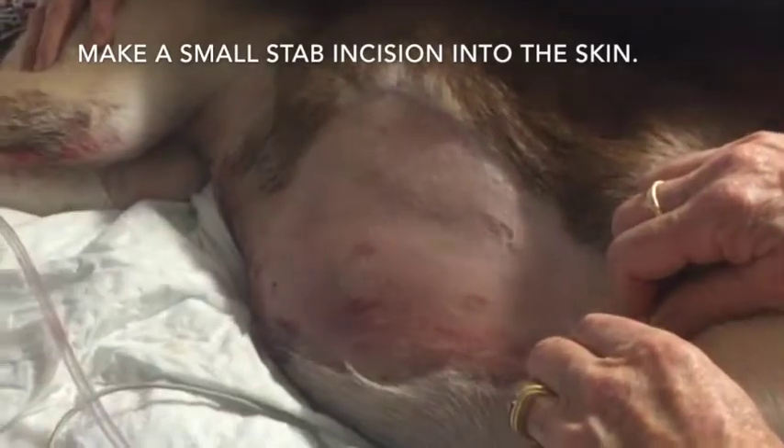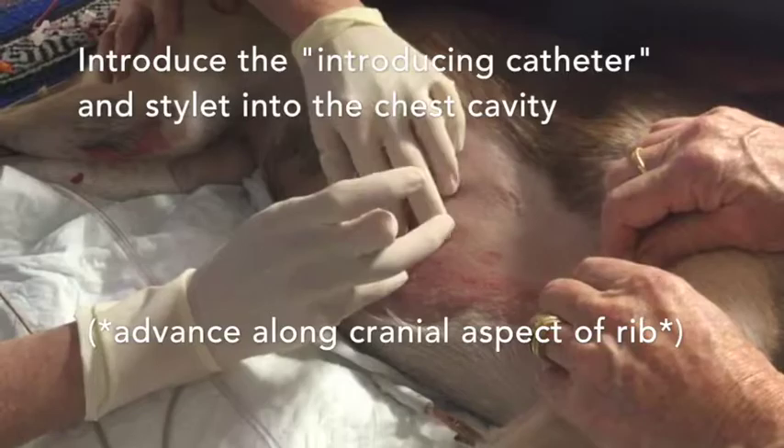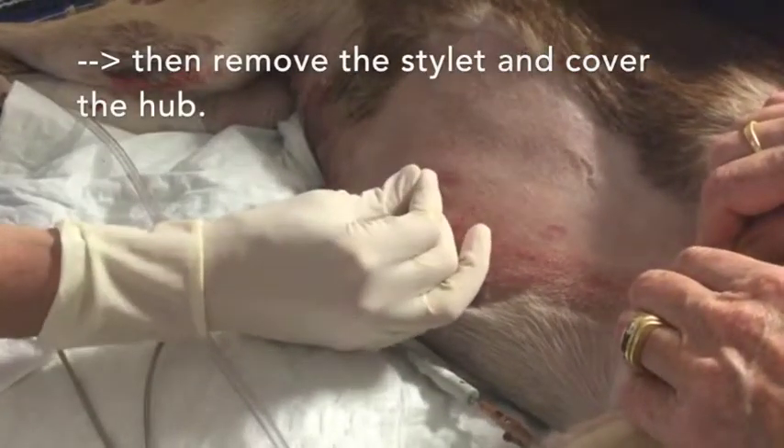Make a small stab incision into the skin, being mindful of depth and advancing along the cranial aspect of the rib. Introduce the introducing catheter and stylet. Remove the stylet and cover the hub.